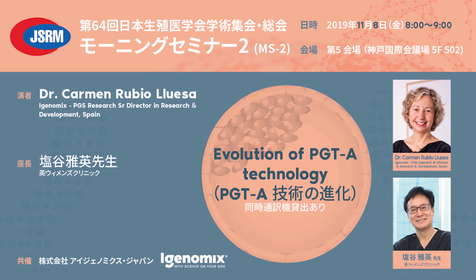The concordance rate of day 5 spent media is lower than day 6 spent media. So should we culture the blastocysts until day 6? I'm afraid that on day 6, blastocysts hatched, sometimes hatched. And on day 5, some good quality blastocysts start hatching. So to manipulate the day 6 blastocysts is somewhat difficult.